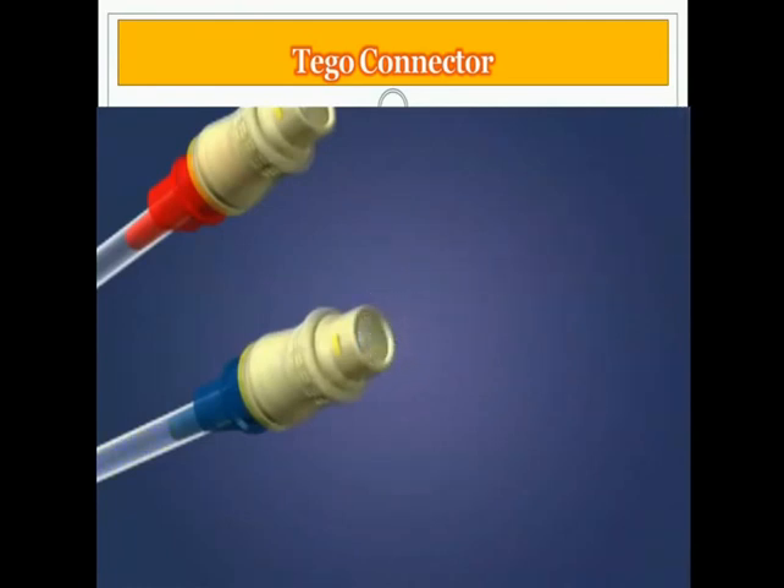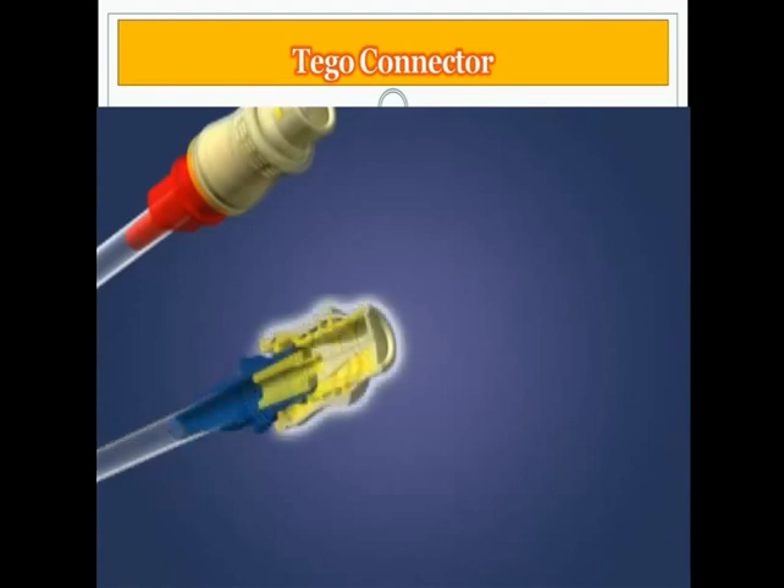When the treatment is finished, the TAGO is left in place on the catheter hub, maintaining a microbiologically and mechanically closed system. The TAGO maintains a seal, thus preventing contamination of the catheter or fluid path at all times.